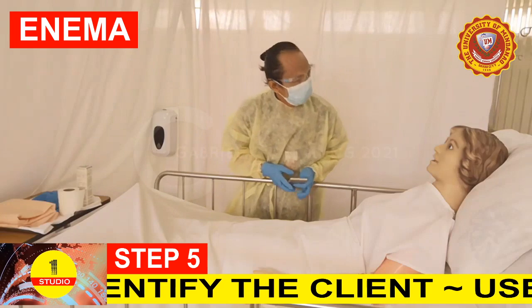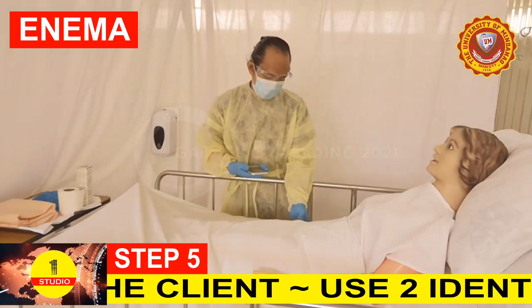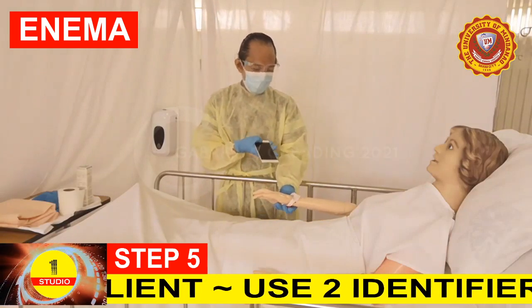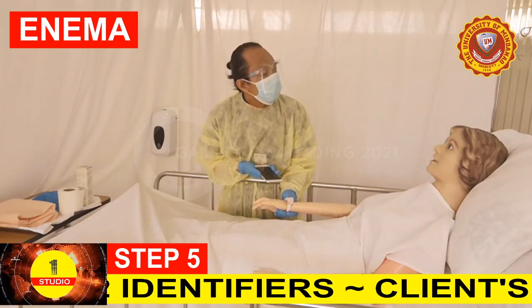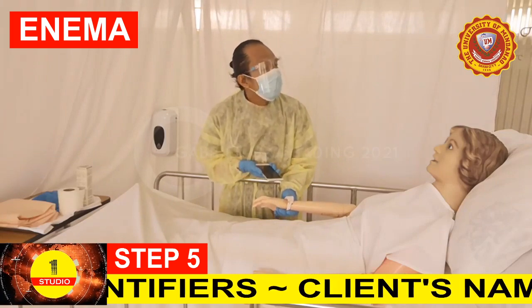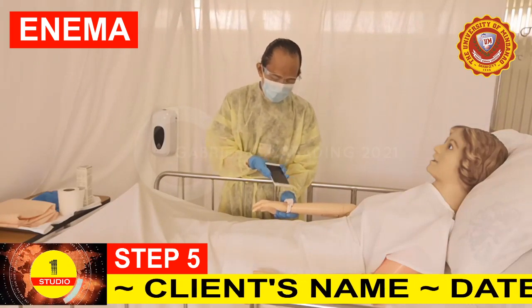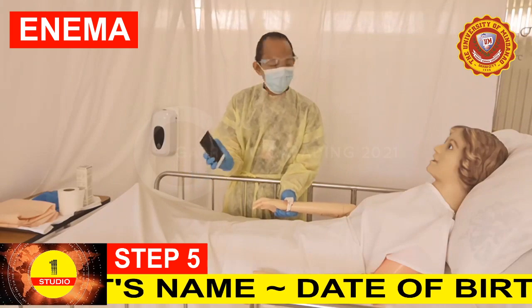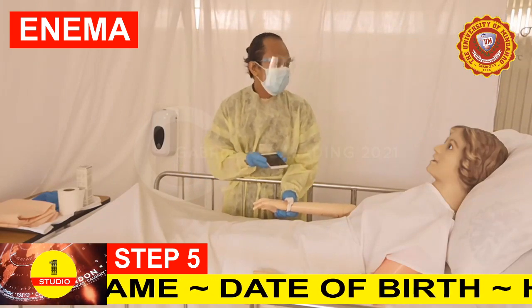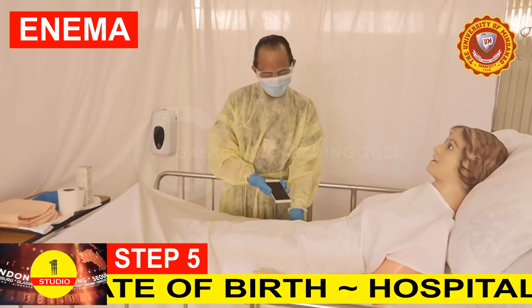Step 5. Identify the client correctly. Use two identifiers before performing any clinical procedures. Identifiers are the client's name, ID or hospital number, date of birth, and address. Also check the client's history of allergy.